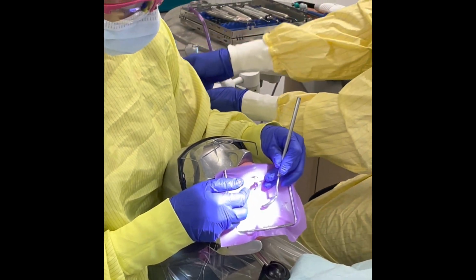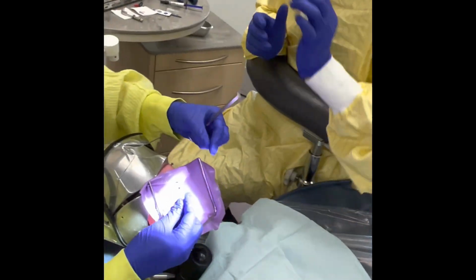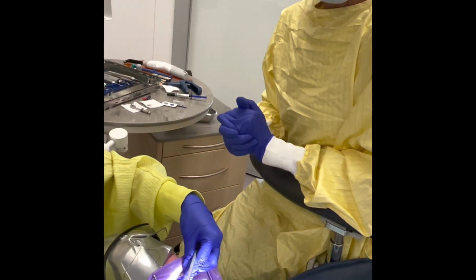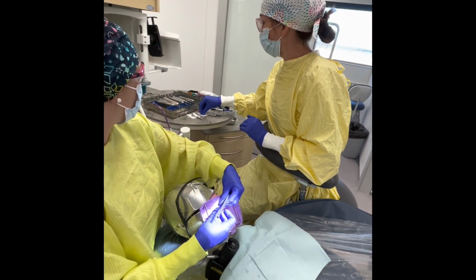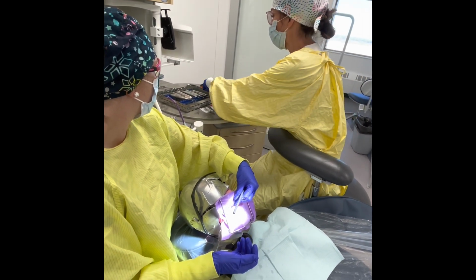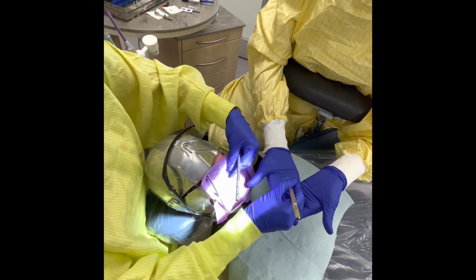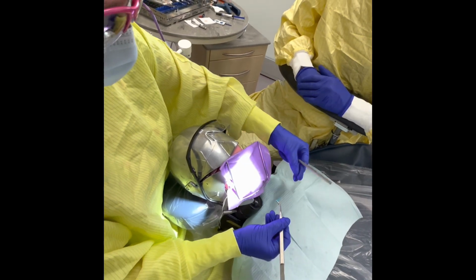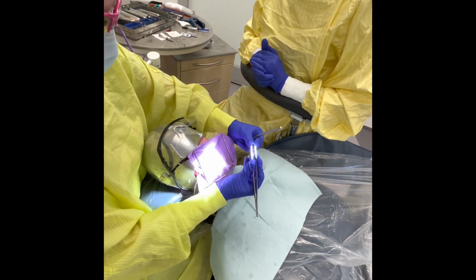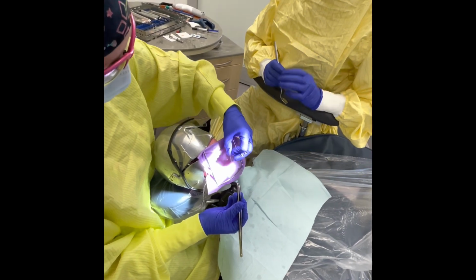Okay. So the first thing I'll do is I'll pass her my plastic strip. And then with a plastic strip, she will need a wedge. I'm just going to ask, what color wedge would you like? I'll take the blue one, please, Stacy. Blue one? Okay. Yes. So I'm going to put that wedge in my hand like so, pass her the intraoral cotton pliers, and she'll just take it from my hand. And I will orientate it how I need to. I'm just going to pass Stacy back my mirror here so I have an extra hand.